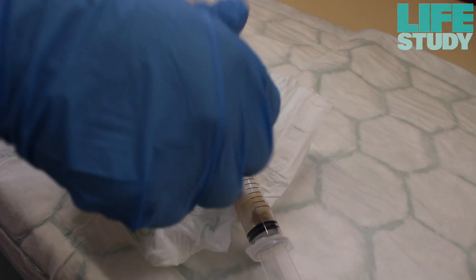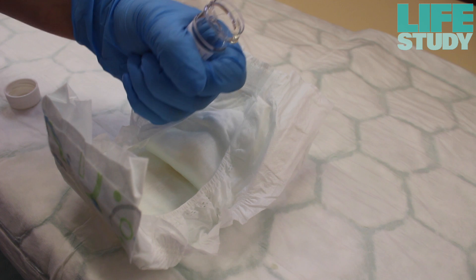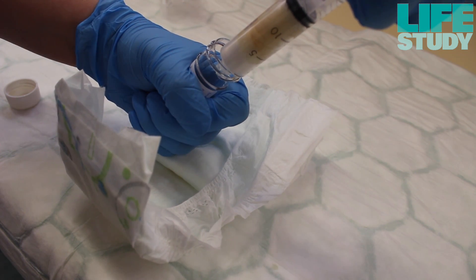Remove the cap from the labelled urine specimen container and place it under the syringe, ready for the collection. Push down onto the plunger and squeeze out as much urine from the cotton wool balls as possible.